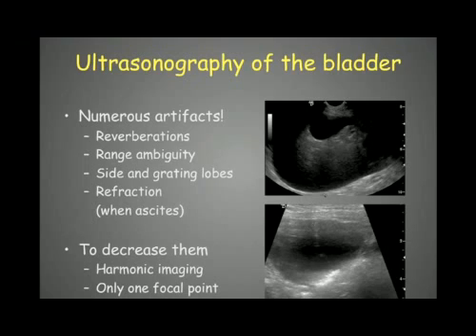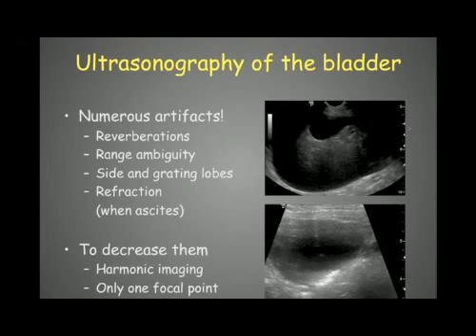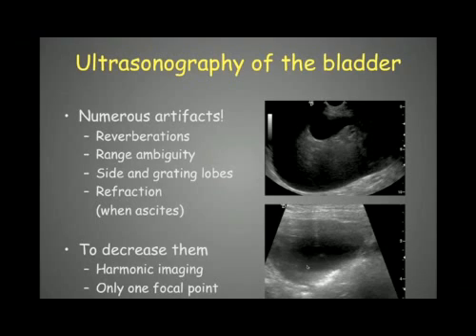We also have range ambiguity artifacts, like we can see here, that create very abnormal images within the bladder lumen. This generally occurs when the bladder is very distended with urine and when we use multiple focal points — we will see this artifact appear. Then we have the side and grating lobes that create a hyperechoic appearance in the dorsal aspect of the bladder. This is also an artifact and we shouldn't think that this is sediment or pathology in the bladder.